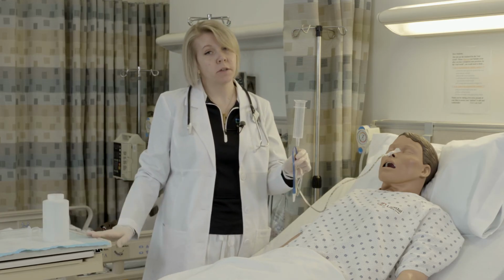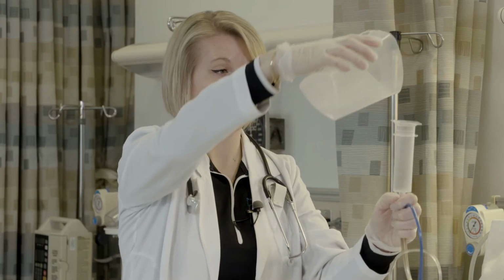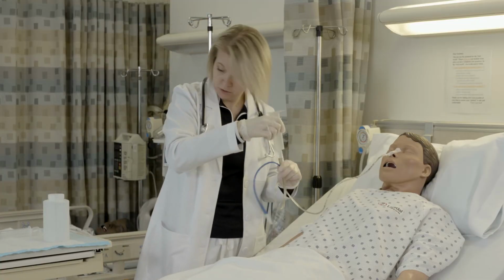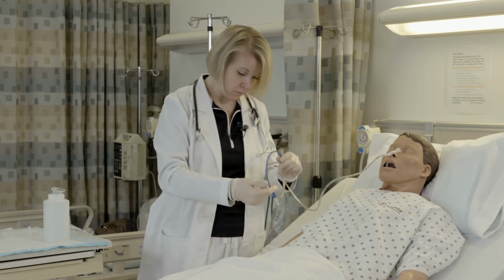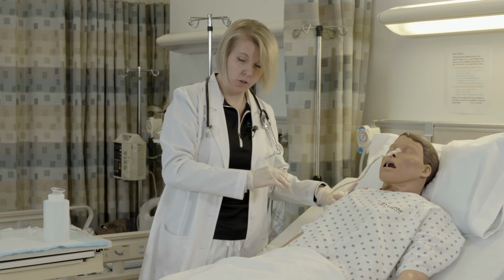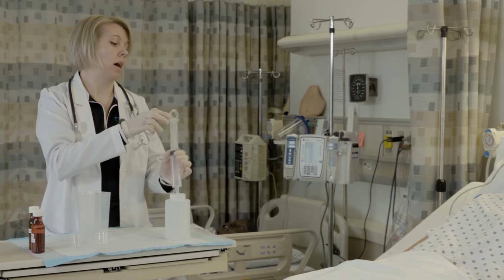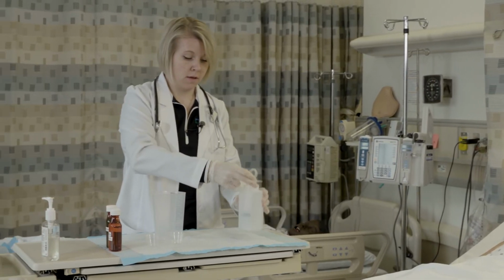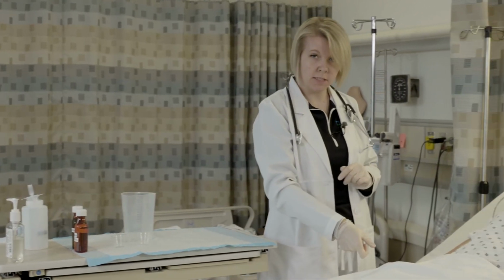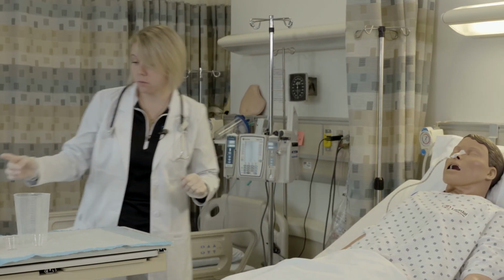And then after we return the gastric residual volume, we're going to need to flush the NG tube with 30 cc's of tepid water. And then we flush that for our patient. And before we give any medication, we need to do our 6 rights of medication. And then our third check of medication is going to be me scanning the patient's band and scanning the medication. So I'll scan the patient's band. I'll ask him for his name and date of birth again, as well as any allergies, and he doesn't have any. And then I will scan the medication.